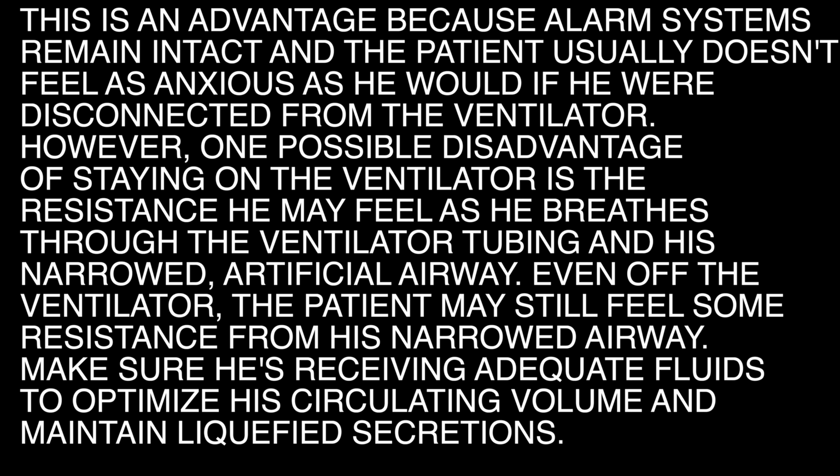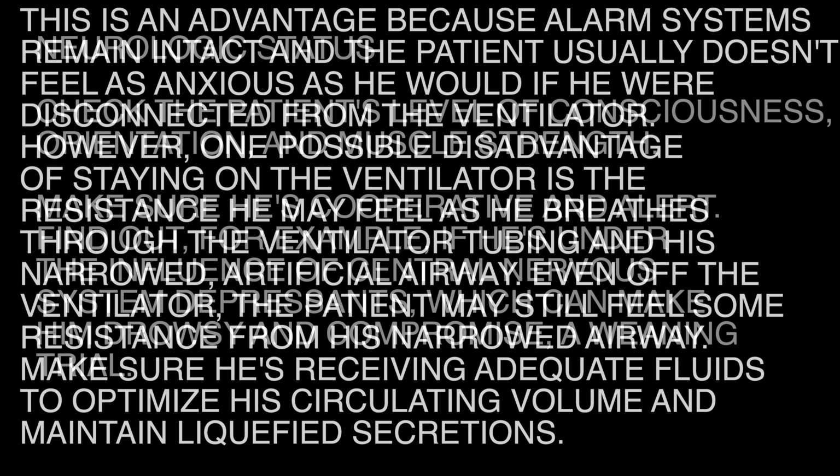However, one possible disadvantage of staying on the ventilator is the resistance he may feel as he breathes through the ventilator tubing and his narrowed, artificial airway. Even off the ventilator, the patient may still feel some resistance from his narrowed airway. Make sure he's receiving adequate fluids to optimize his circulating volume and maintain liquefied secretions.